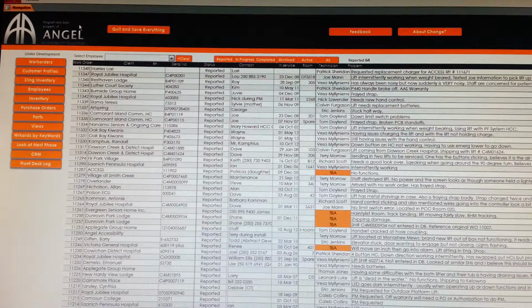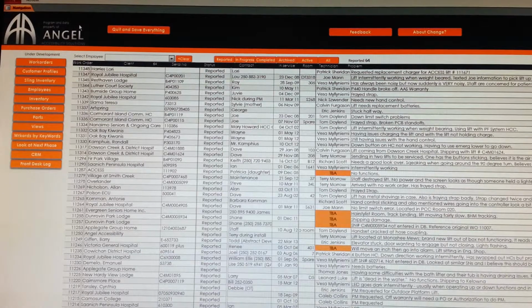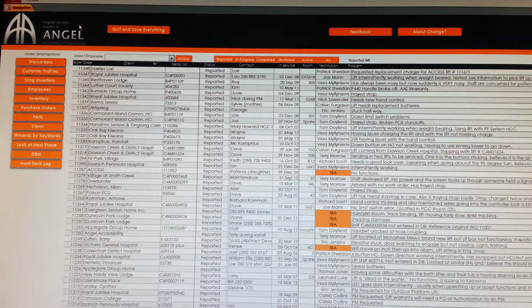Okay, so this is the short instructional video on how to deal with preventative maintenance inspection forms once the technician is done at the facility. You will receive a stack of papers and they need to be entered into the database. And really the reason for doing this is to make sure that the room data is accurate and the serial number data is accurate as well.